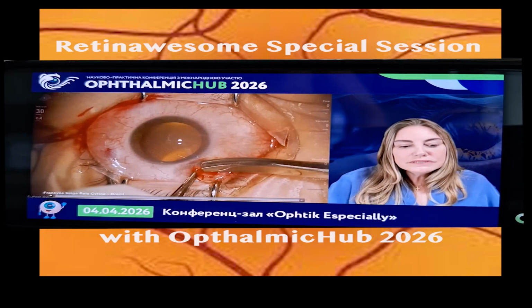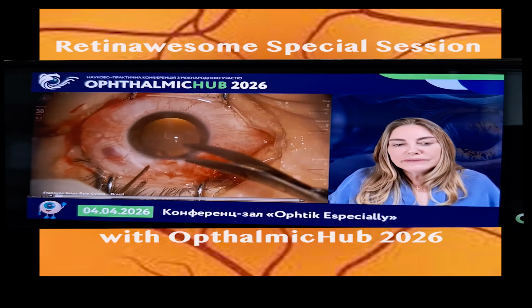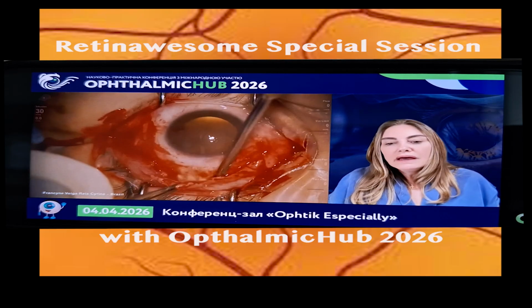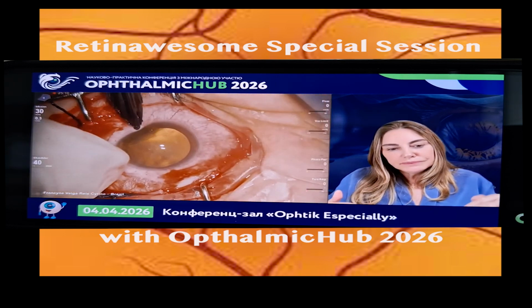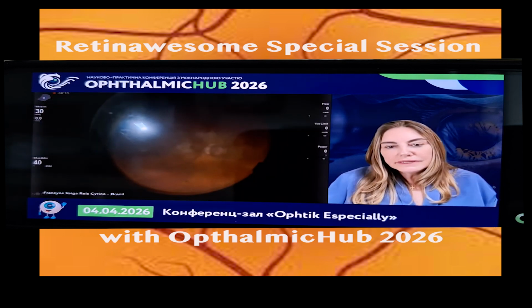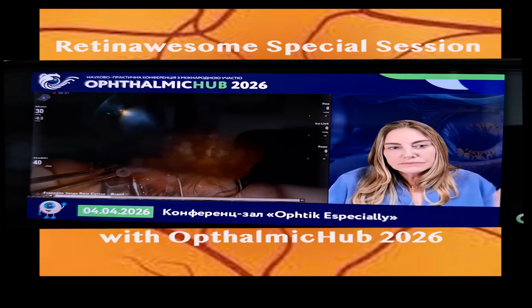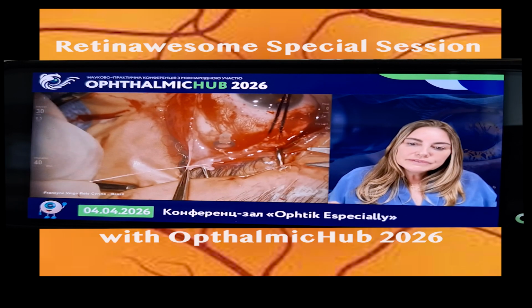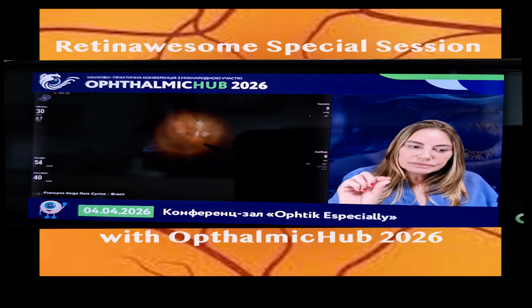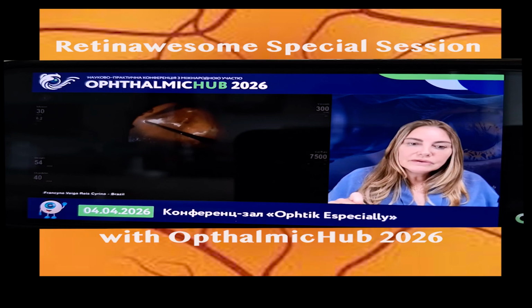So in this case, what we did was to perform a macular buckle. We create one macular buckle here, and we start by opening the conjunctiva and isolating the muscle. Then we put the buckle under the macula, and we check if it's in the right position with the chandelier. If it's in the right position, we fix it with double sutures, because we leave a small part of the sleeve to protect the buckle.